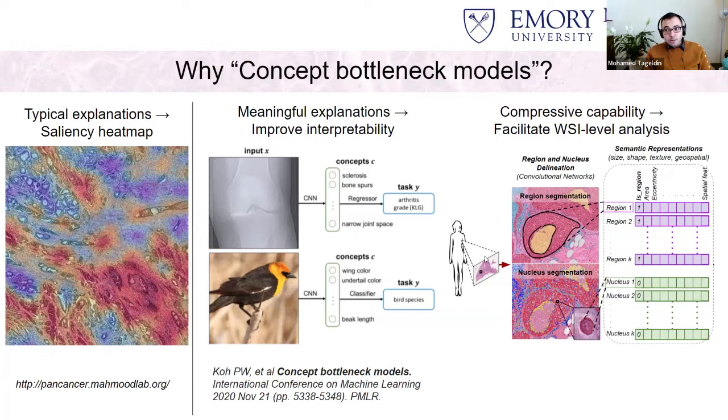What was done in the past, though, before the deep learning revolution, I think in 2012, if I'm not mistaken, and even now in some limited applications, is mostly done manually. So you would say, if a nucleus is large enough, or if it looks ugly enough, or if it's in the right place, then therefore this is a cancer nucleus. And as you can tell, because it is very manual, first of all, it's not very robust, because what you think is important may not be translated well across different centers.